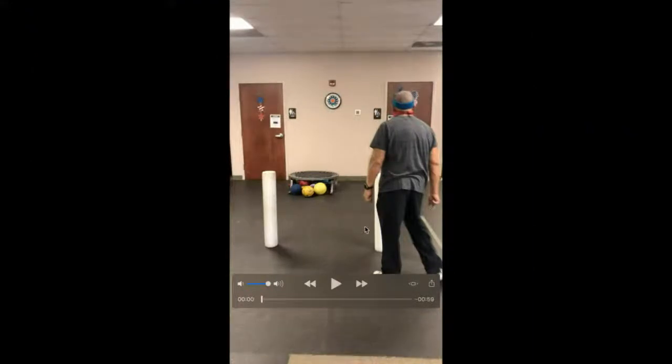This is a common one. This is called infinity walking or butterfly walking. So this is a pretty common setup in clinic, but I want to show you the dynamics of adding in visual feedback immediately for what you might be able to see for decompensations and where you might need to train. These are common applications that we see on social media or in some educational series of just being able to do this. And people mark these as, well, you're getting different parts of the vestibular system, the visual system, body awareness, mechanoreceptor integration, and of course, being able to turn with the head, neck, as well as the inner ear. And yes, those all check that box.